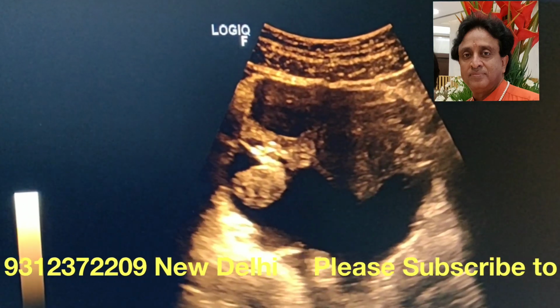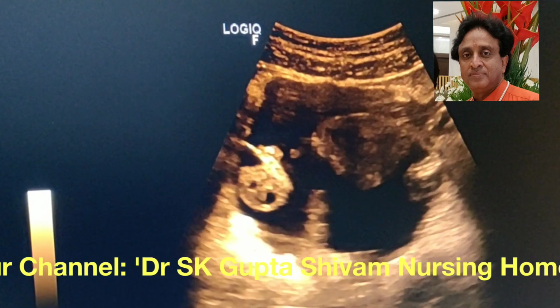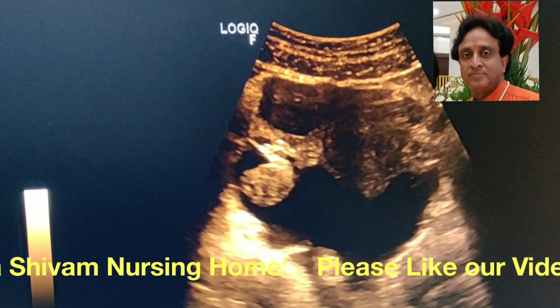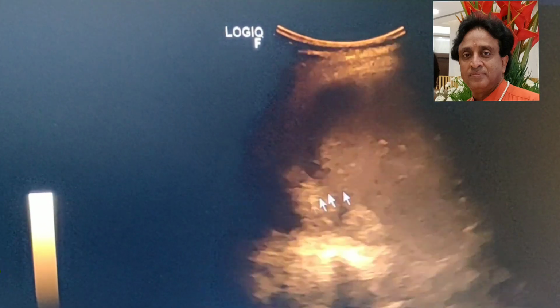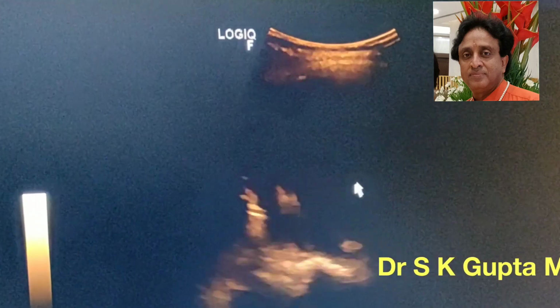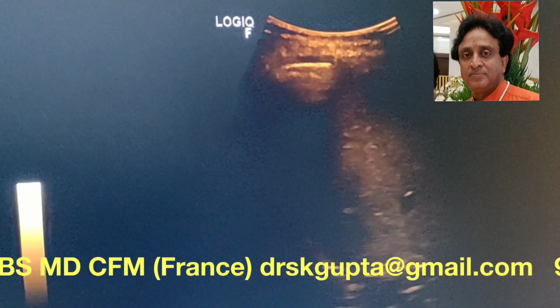And now, as I suggested to you, you should look for effusion in the pleural cavities. We are going to look for the effusion in the pleural cavities. This is the chest being seen in the intercostal space, and down below we see that there is fluid around the liver. And on the left hand side we find that there is free fluid around.